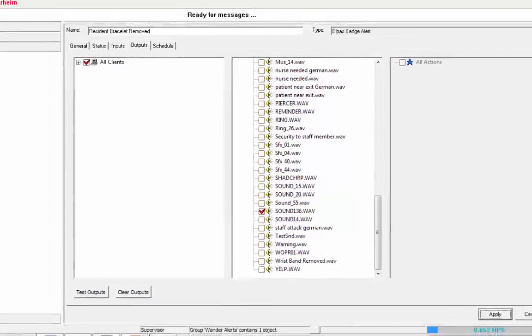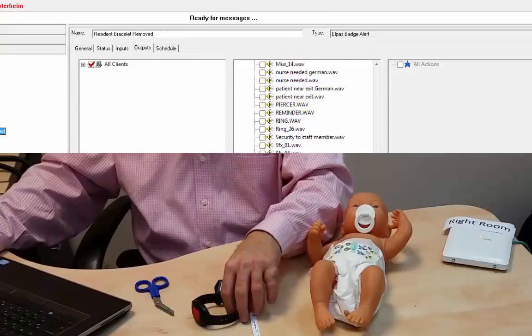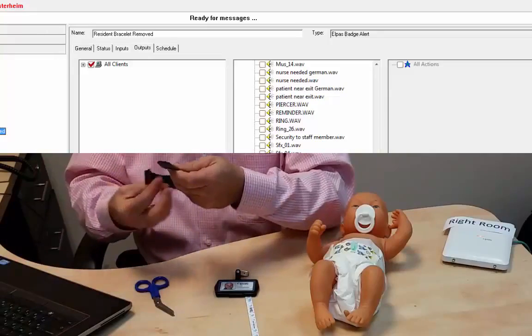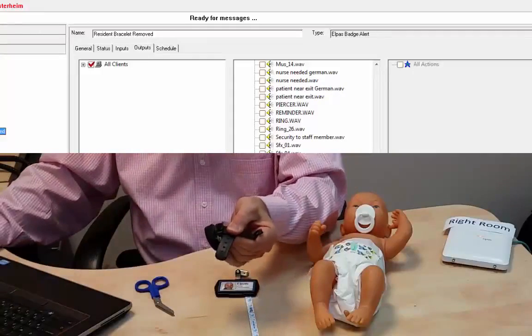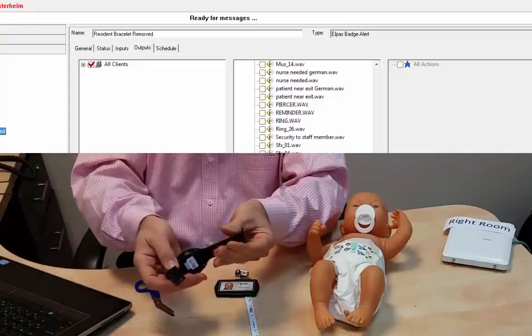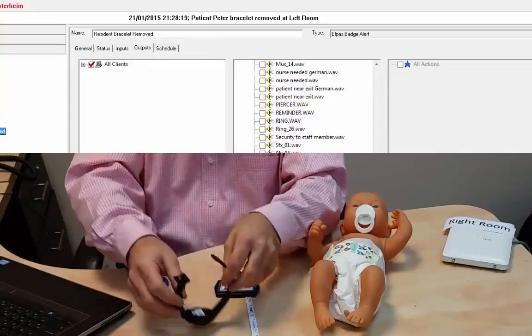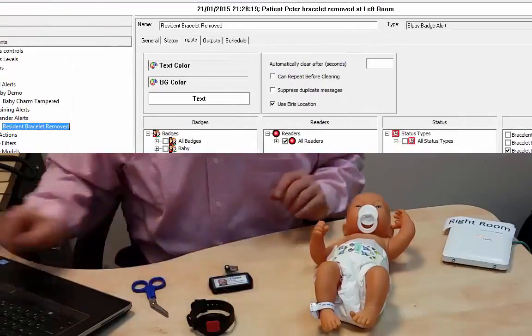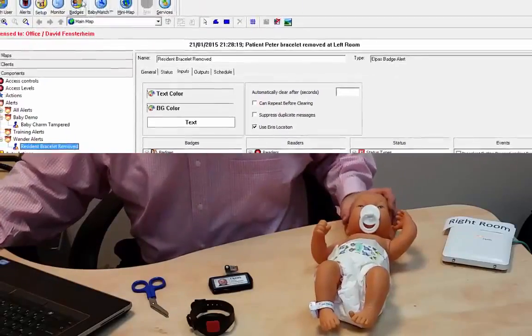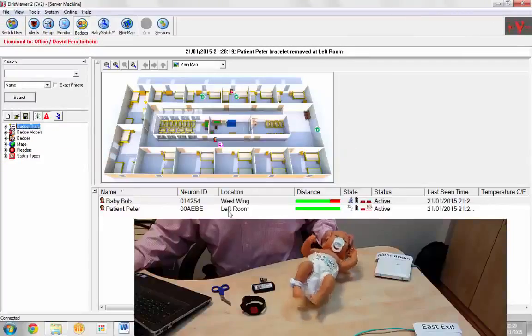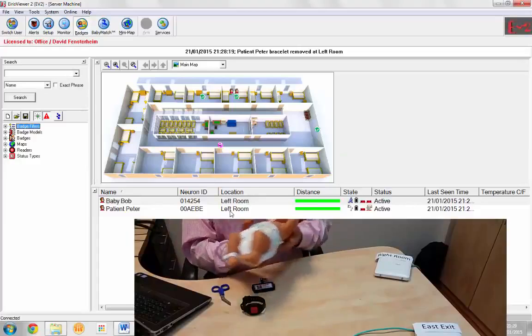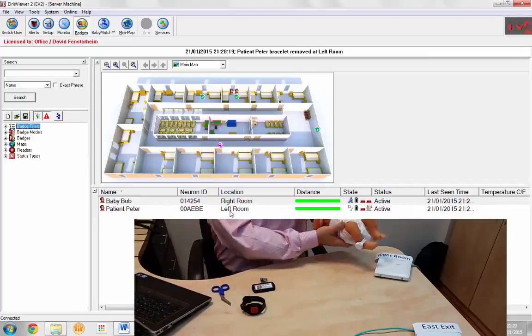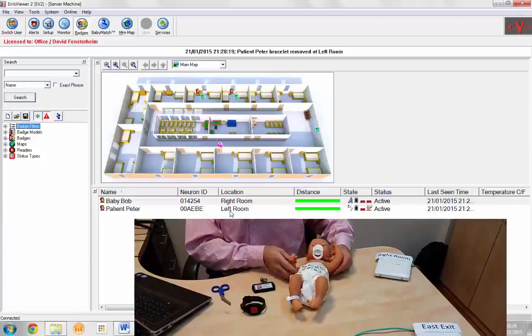So right now, if I take my bracelet, I close the bracelet, and then I open the bracelet, I get my alarm. Our infant tag is back on. Infant tag is located in a left room or the right room. Good. Baby Bob.